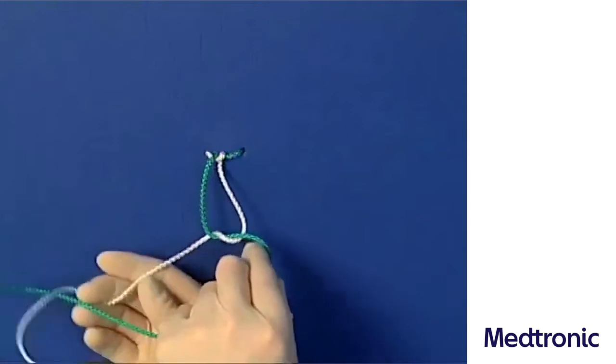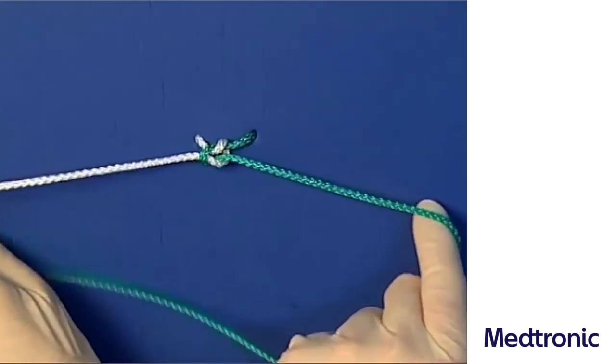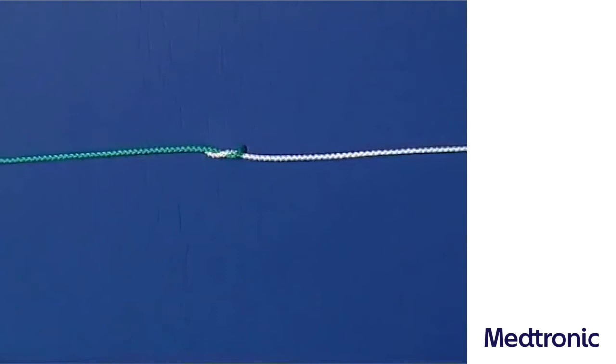In order to lay this loop flat, the hands have to be crossed clockwise prior to applying opposed pulling force. This is how the sailor's knot is tied.